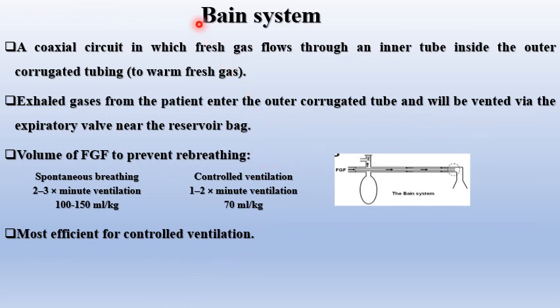Two examples for circuits are Bain circuits, our Bain system, and Jackson-Rees modification of Ayre's T-piece.